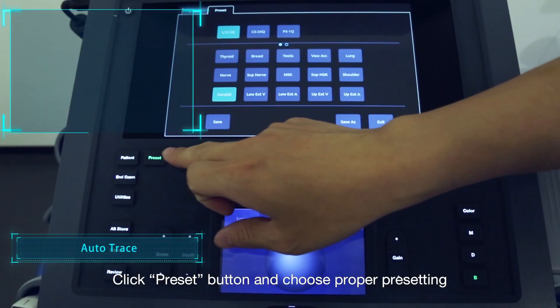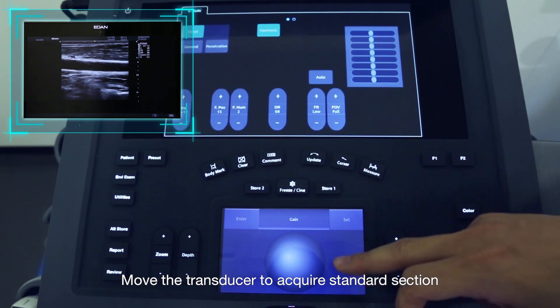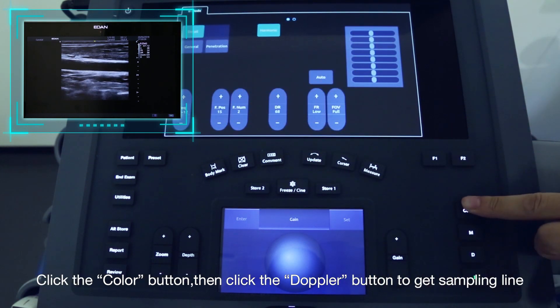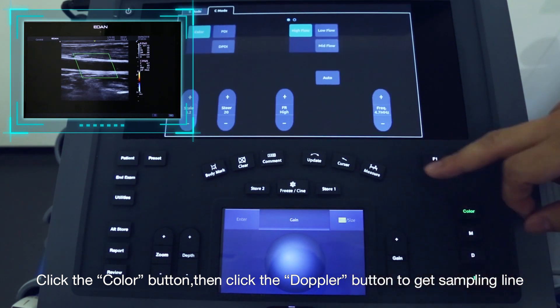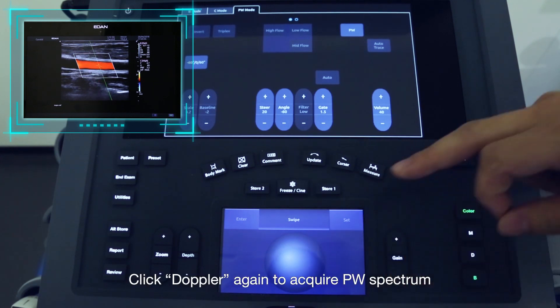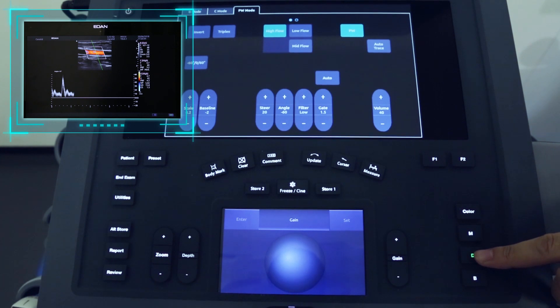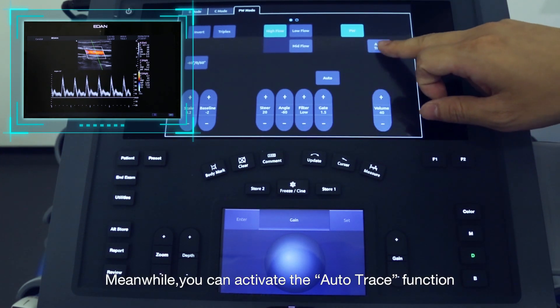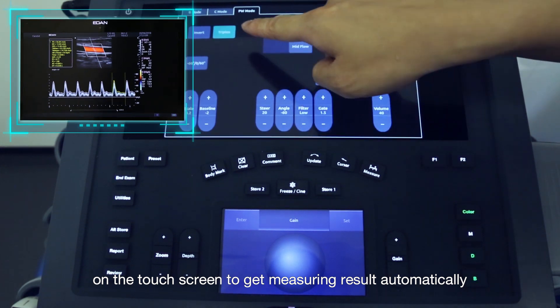Click the Preset button and choose the proper presetting. Move the transducer to acquire a standard section. Click the Color button, then click the Doppler button to get the sampling line. Click the Doppler button again to acquire the PW spectrum. You can activate the Auto Trace function on the touchscreen to get measuring results automatically.